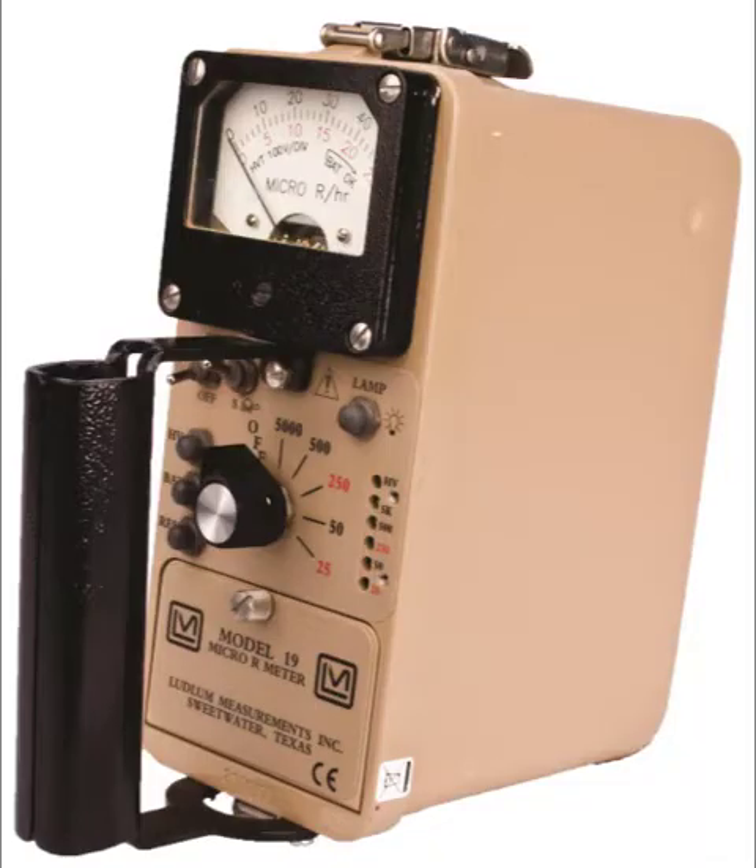The Ludlum Model 19 is a very sensitive meter designed to detect low-level gamma radiation. It can measure from 0 to 5,000 micro-R per hour. It uses an internally mounted 1 by 1 inch sodium iodide scintillation type detector.